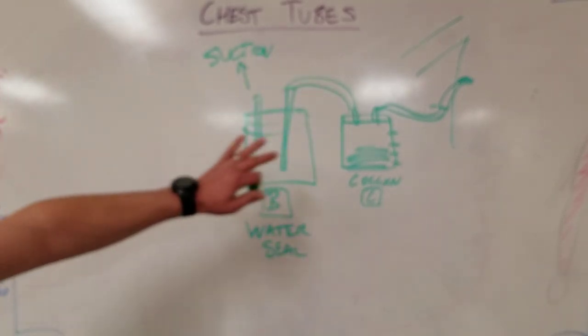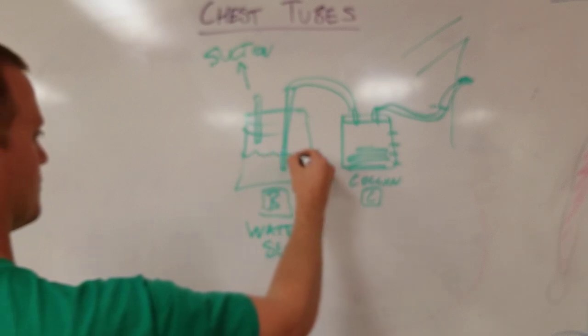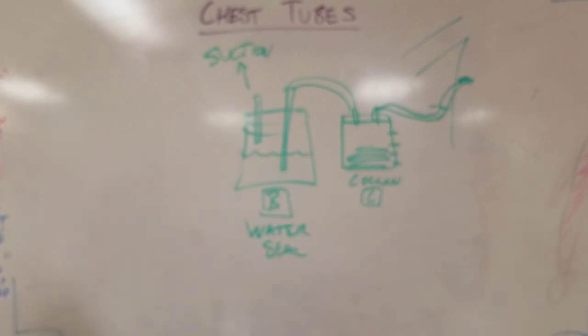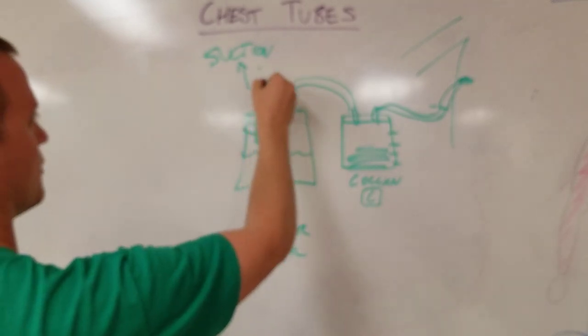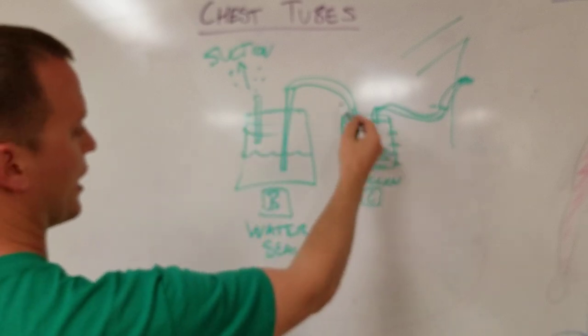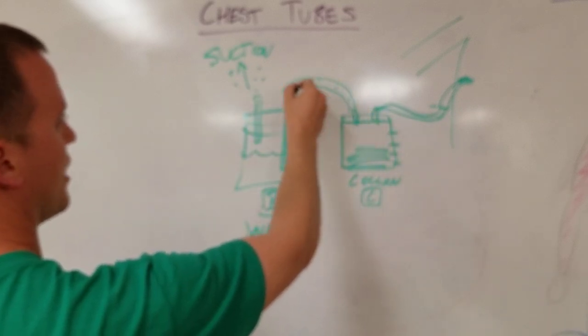This chamber is a little different than the Charlie one in that we preloaded it with some water, okay? And this gets a little complicated, but if you bear with me, I think you'll figure it out pretty quickly. So suction, so we're pulling all the air out. The fluid out of the chest has already been collected, so the only thing coming through here is air.